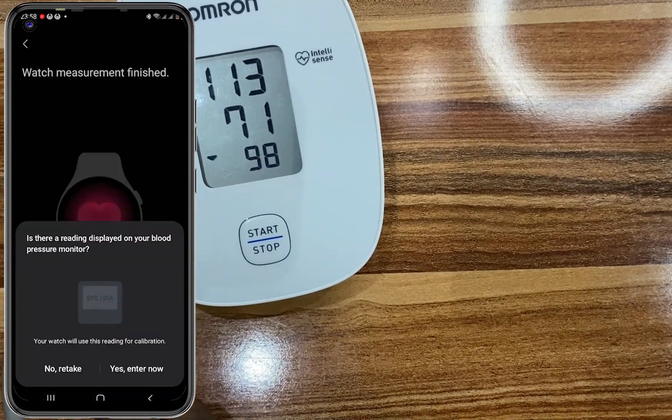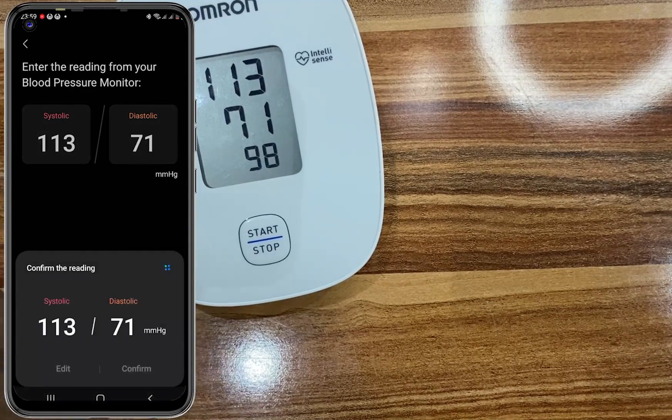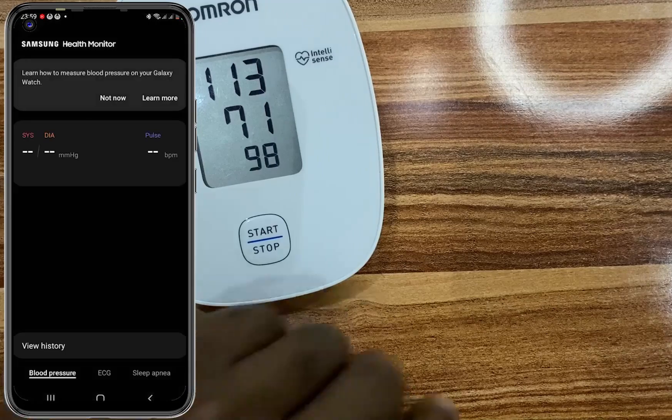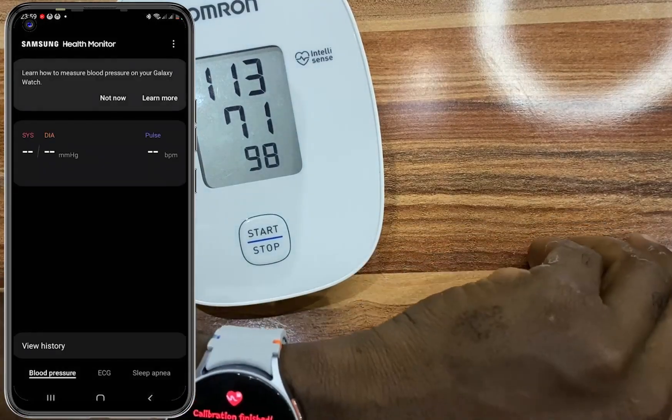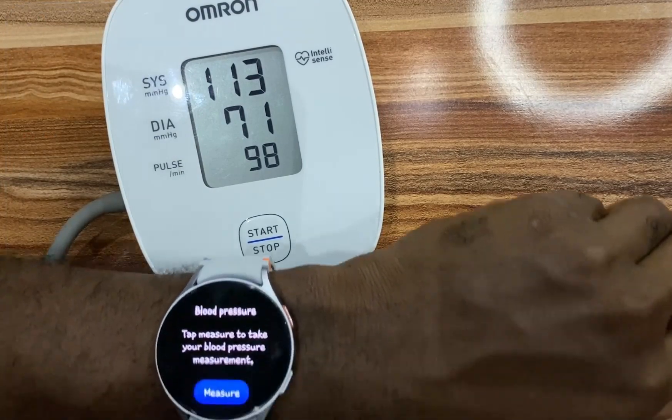We have the last measurement. Go ahead and enter that and confirm. That's it — we have successfully calibrated the watch to measure blood pressure, and I can now go ahead and take my first measurement.